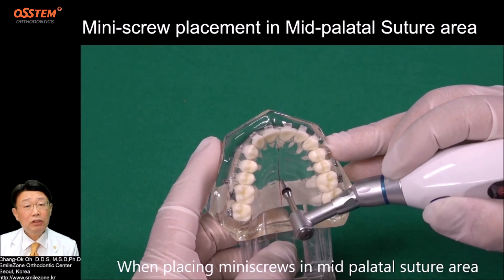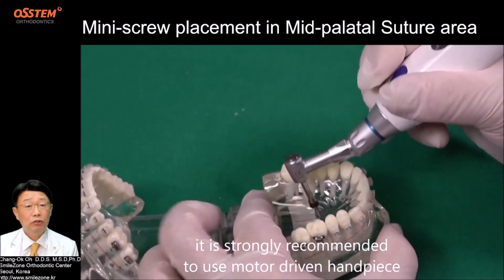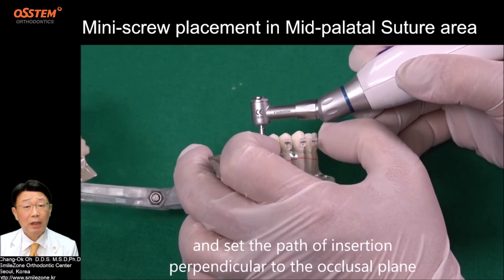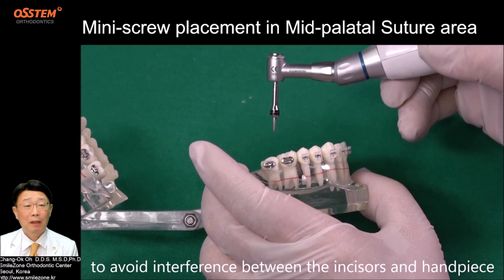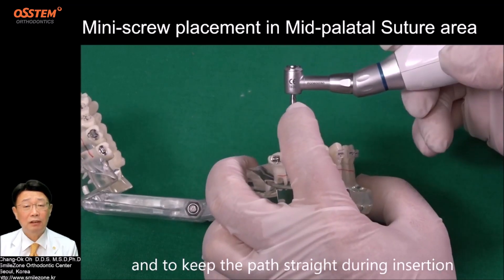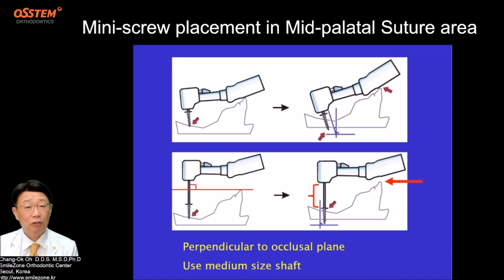When placing mini screws in the mid-palatal suture area, it is strongly recommended to use a motor-driven handpiece with a mid-size length shaft rather than a short one, and set the path of insertion perpendicular to the occlusal plane to avoid interference between the incisors and the handpiece, and to keep the path straight during insertion. Perpendicular to the occlusal plane — use medium-size shaft.